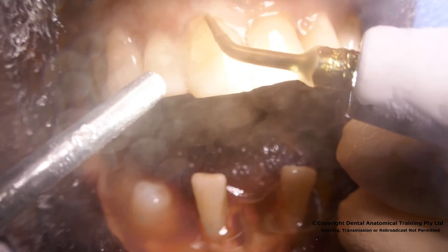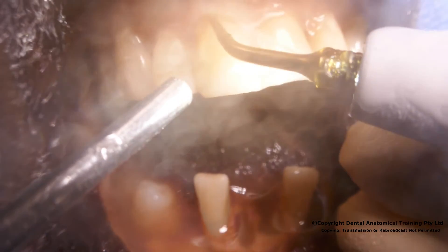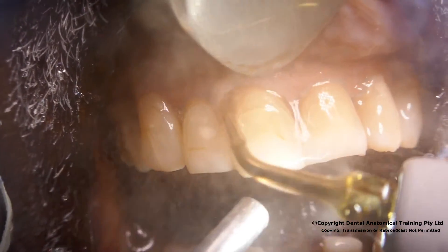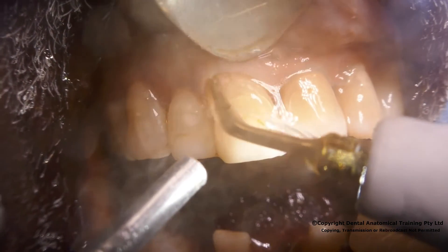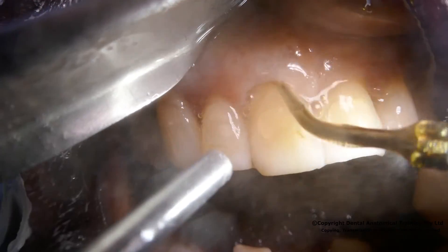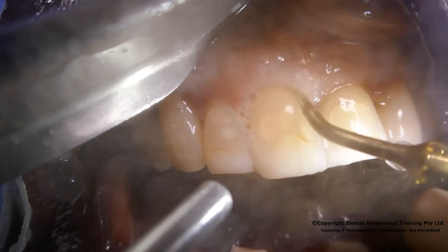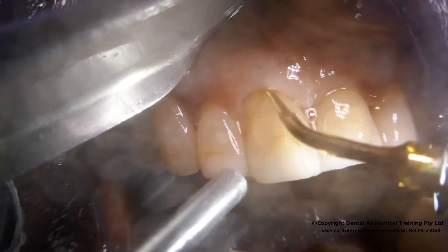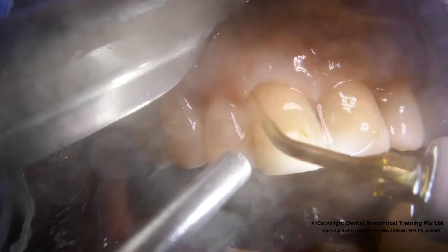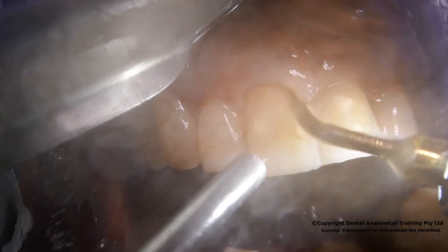Here we can see the instrument inserted into the periodontal membrane space and gently pistoned up and down, maintaining the blade parallel at all times with the root surface. The blade is moved gently along the periodontal membrane space so as not to concentrate heat in the area, gently severing the connection of the periodontal membrane in the cementum layer.